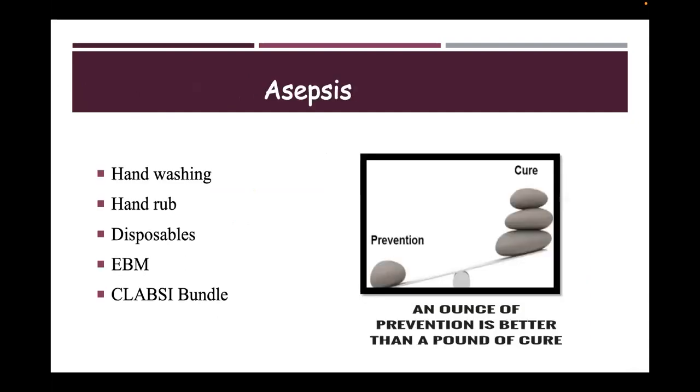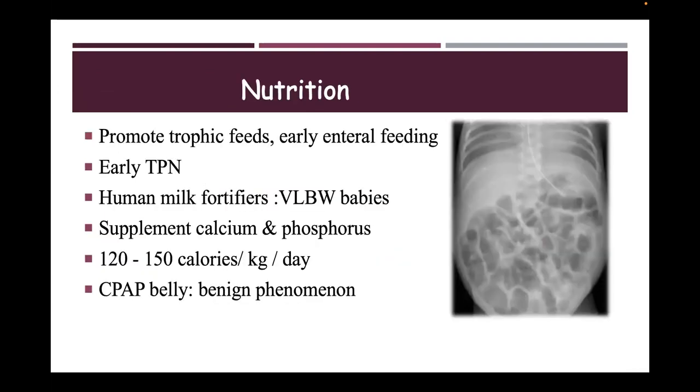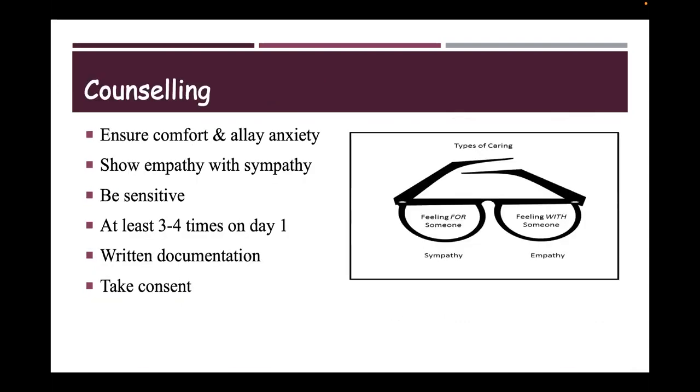Now, always maintain asepsis, do proper hand wash, do clustering of procedures, use disposables wherever possible, and ensure good nutrition for babies on CPAP. Remember, CPAP is not a contraindication to feeding. Babies can be on full feeds despite being on CPAP, or for that matter, ventilation.